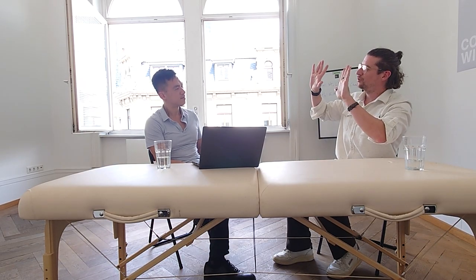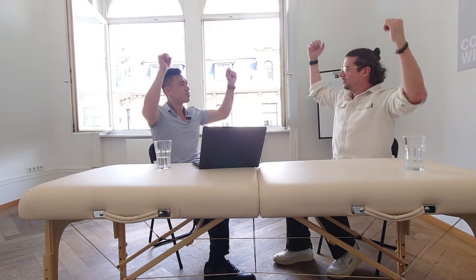You should know which muscle is the main character in that specific movement. If we focus on pull-ups, the scapular setting is a really important one. There is a good study which was done with the lat pull down machine.